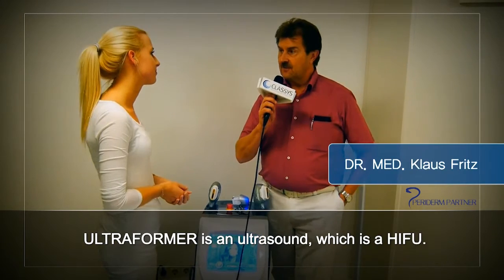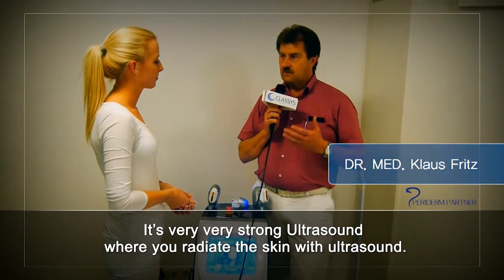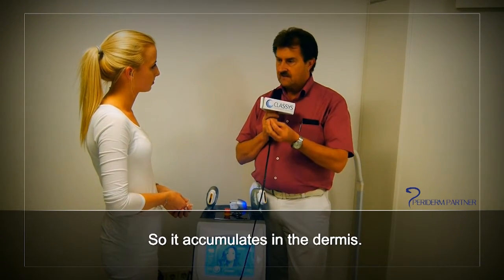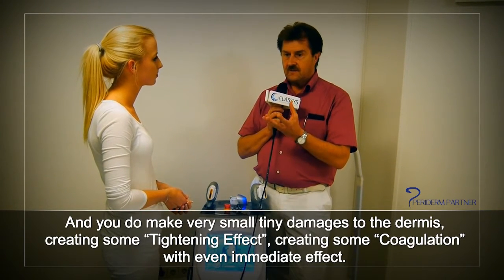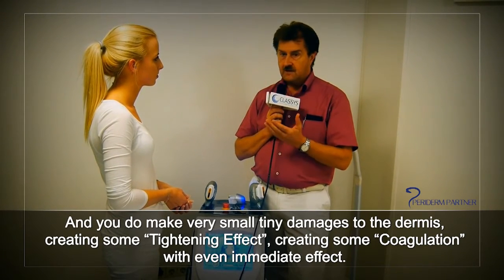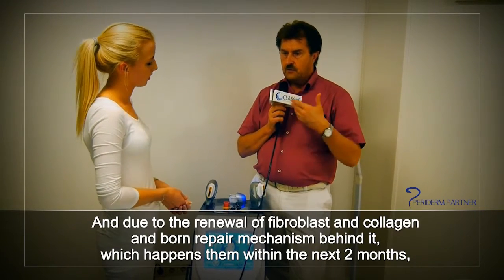Hello Dr. Fritz, how does the Ultraformer work? The Ultraformer is an ultrasound — a HIFU, a very very strong ultrasound — where you irradiate the skin with ultrasound so it accumulates in the dermis and you do very small tiny damages to the dermis, creating some tightening effect and some coagulation as an immediate effect.